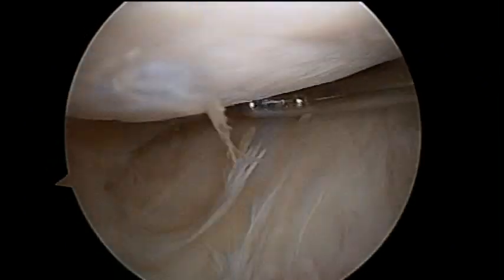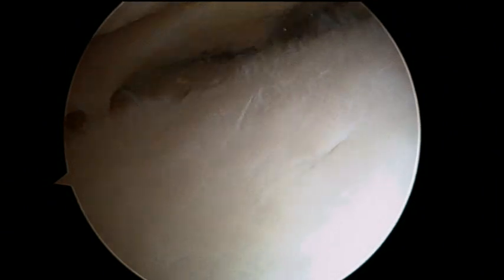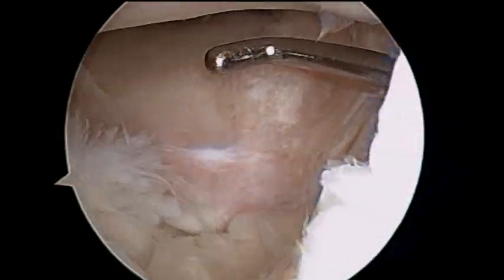First of all, the lateral femoral tibial compartment of the right knee is explored. The avulsion of the anterior root of the lateral meniscus and the chondral lesions are checked.